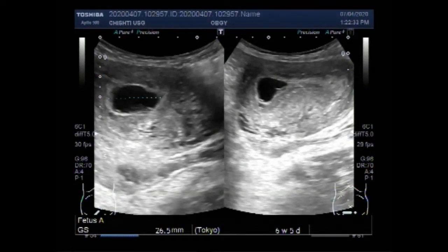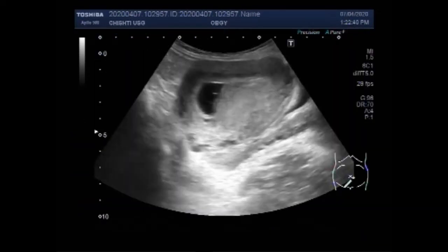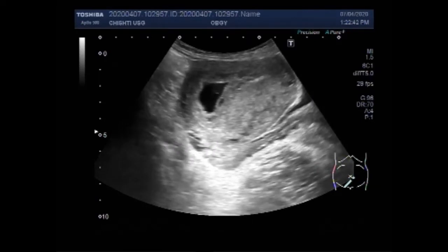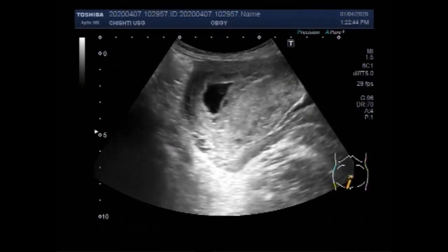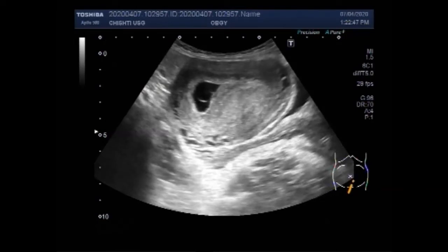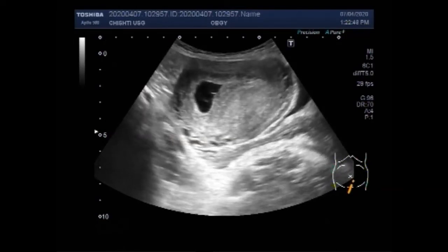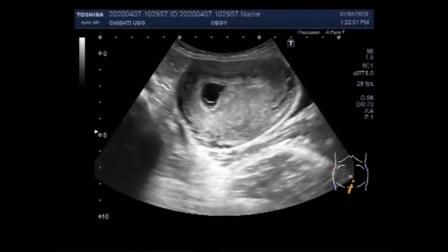Dear viewers, I hope you are all fine. This ultrasound video shows a pregnancy with blighted ovum, or anembryonic pregnancy. The gestation sac is a large cavity of fluid surrounding the embryo. You can see the gestation sac in the uterus.